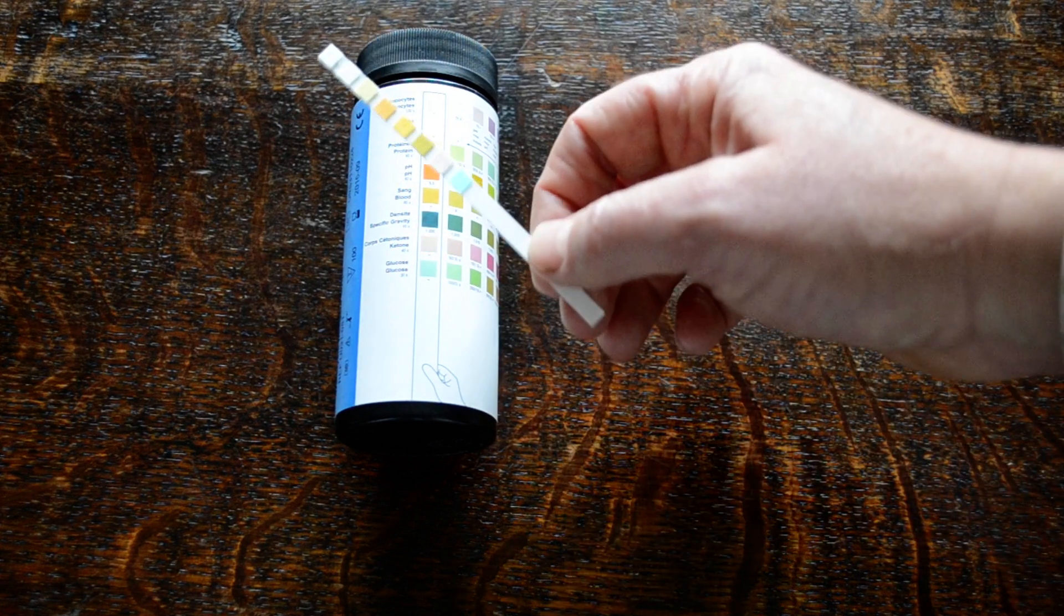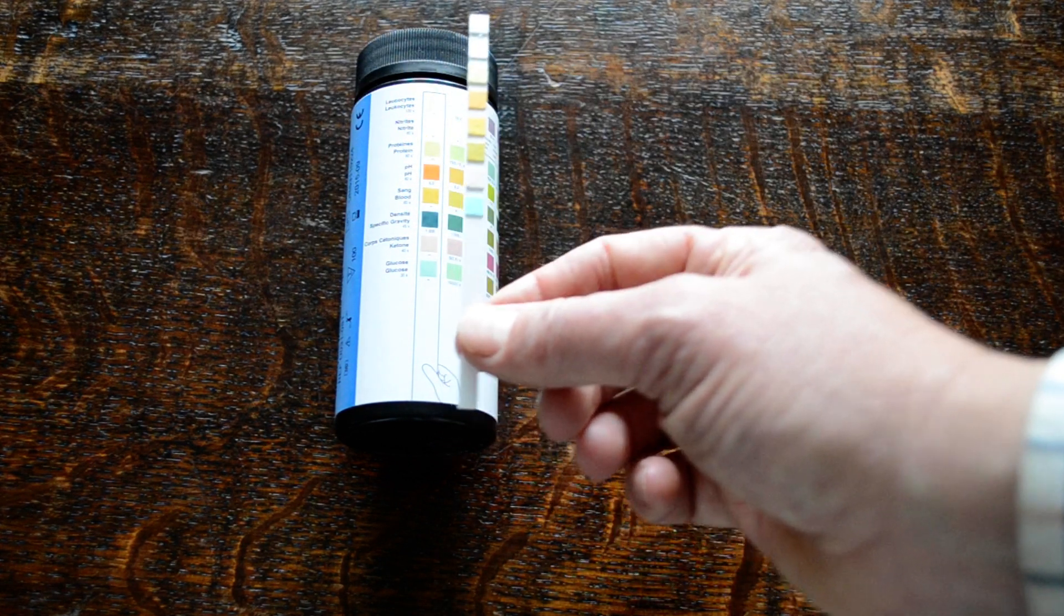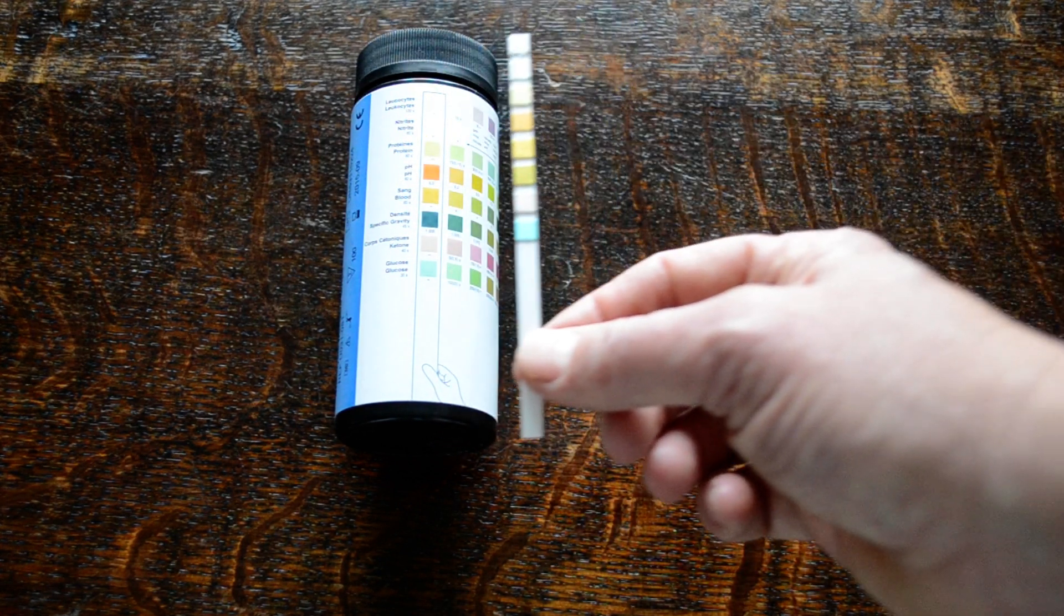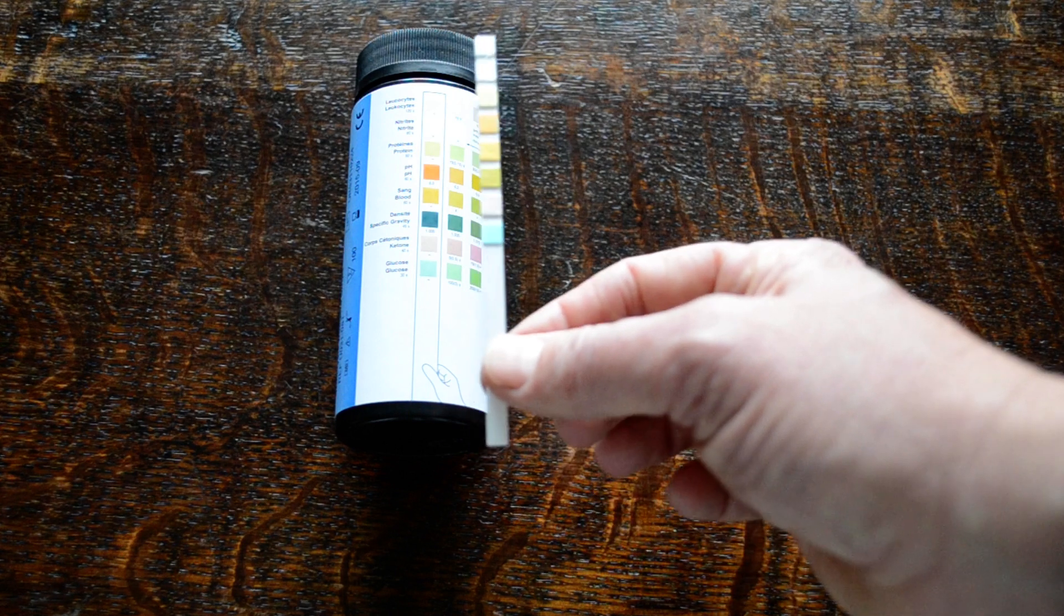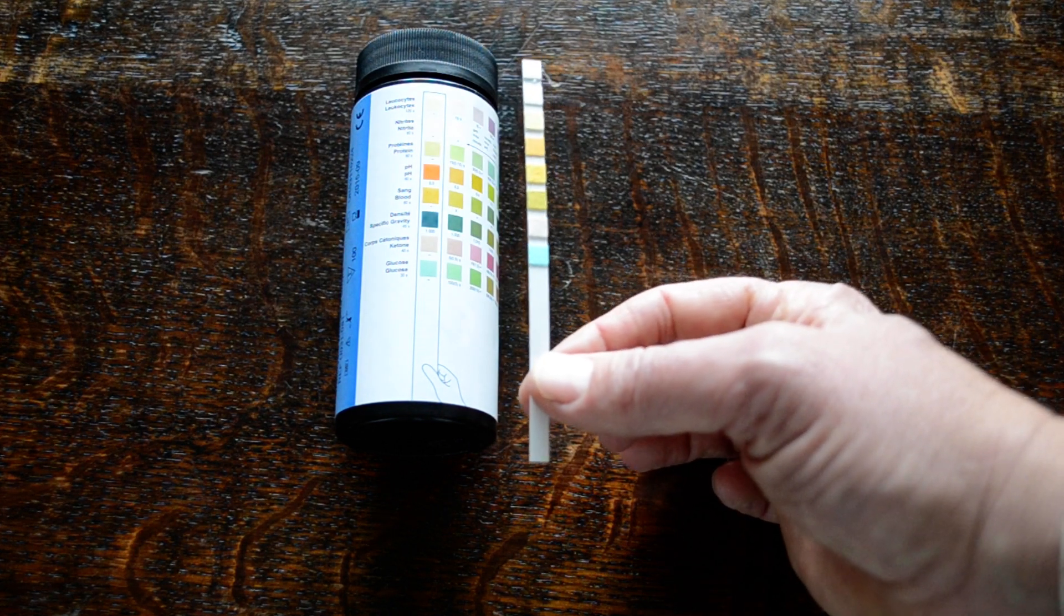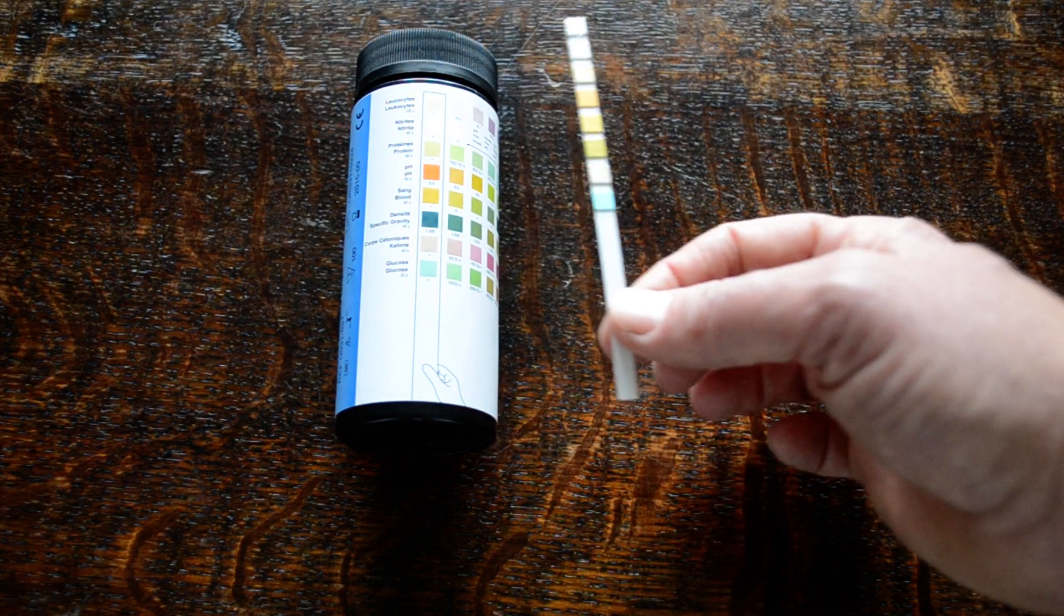Even if the expiry date is good, if they've absorbed too much moisture, then they've gone off.